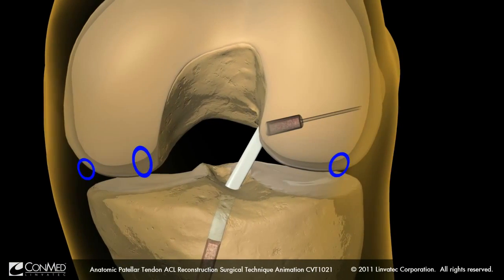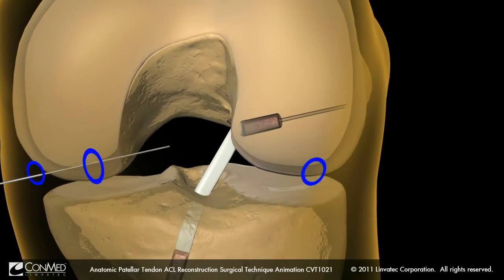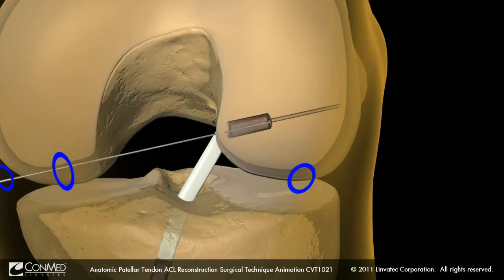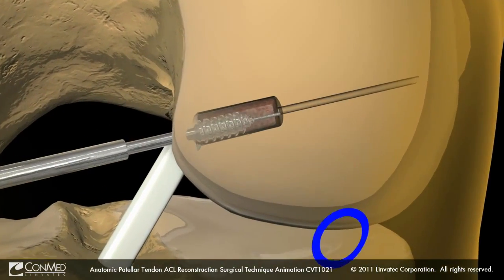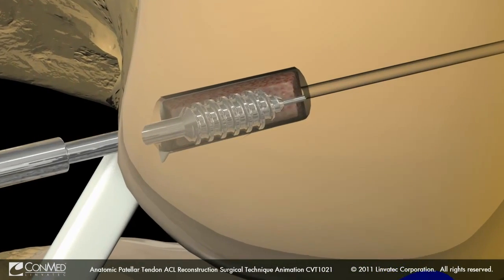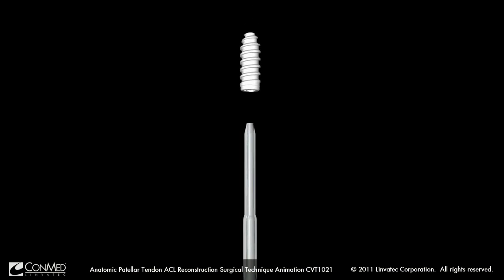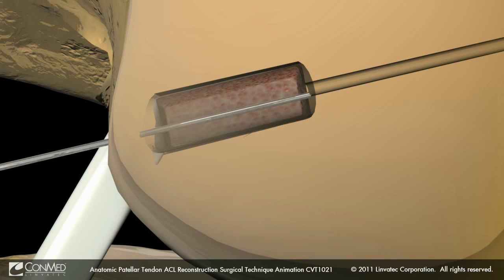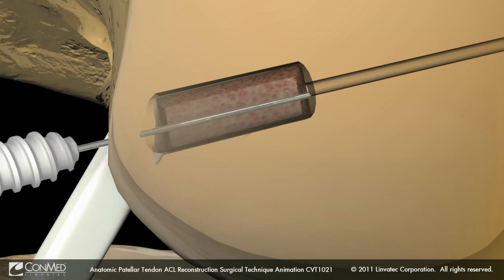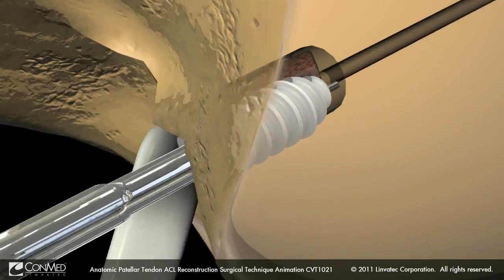Once the graft is positioned appropriately in the femoral tunnel, insert the bioscrew hyperflex guide wire through the AAM portal and into the femoral tunnel. Advance the tap, rotating clockwise until the appropriate depth marking, to create threads in the femoral tunnel and BTB graft. Remove the tap from the joint, leaving the guide wire in place. Load the Genesis matrix interference screw onto the trilob driver and slide onto the guide wire into the joint until flush with the aperture and graft. Insert the screw anterior to the graft for fixation, then remove the driver and guide wire from the joint.